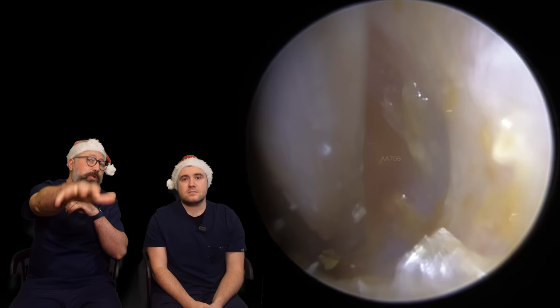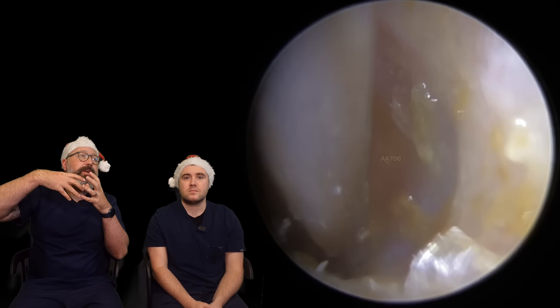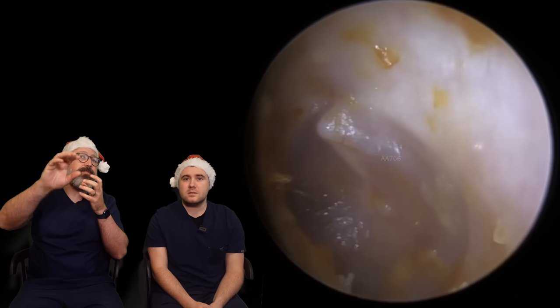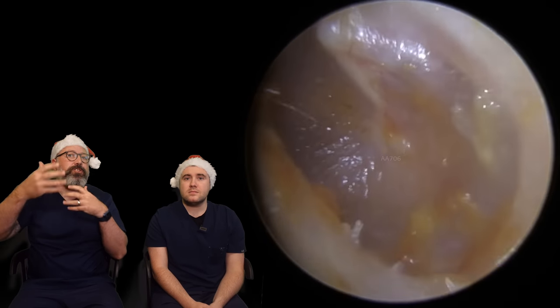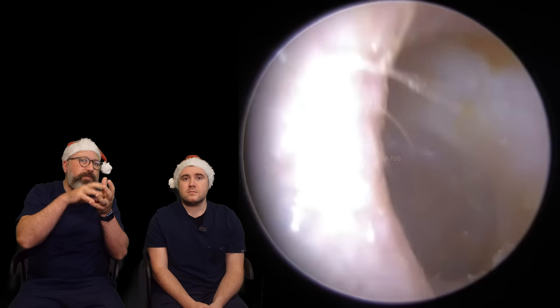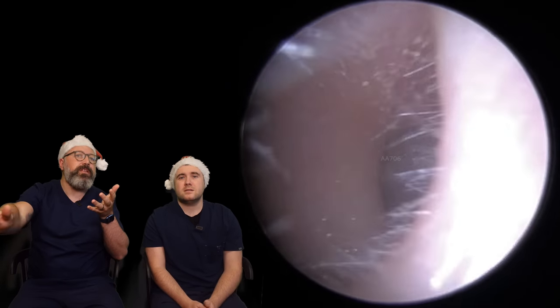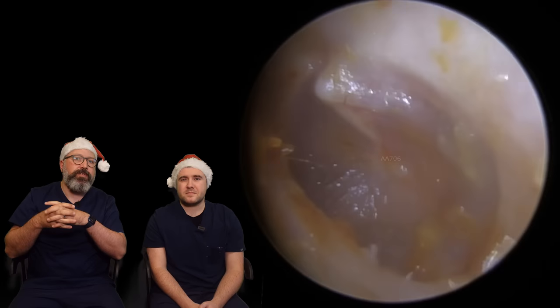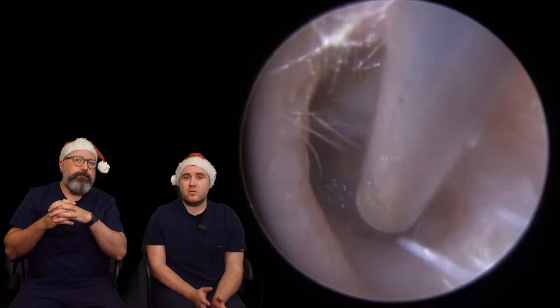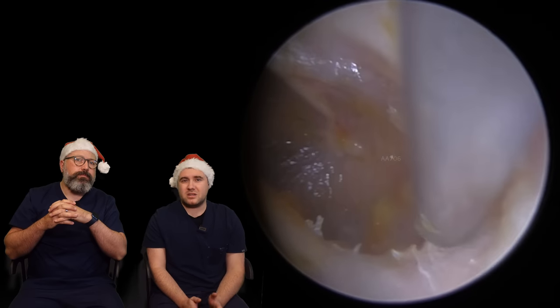Where the wax is stuck at the moment is at the bottom of the eardrum — that's your pars tensa, the bit that passes the majority of sound through when it hits the eardrum. The top is the pars flaccida, which was already exposed and is not as good at transmitting sound. What this means is that the part of the eardrum that vibrates and gets most of the sound through has been completely covered with wax, which is why the patient is having so much difficulty. We've luckily managed to remove all the troublesome wax from in front of the eardrum, so this is just the tidying up.